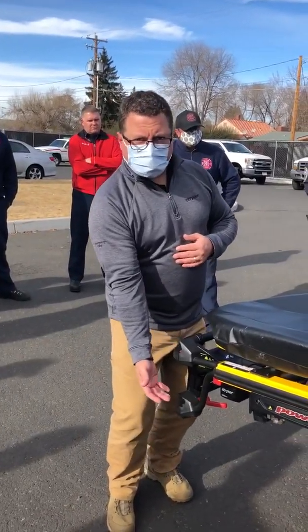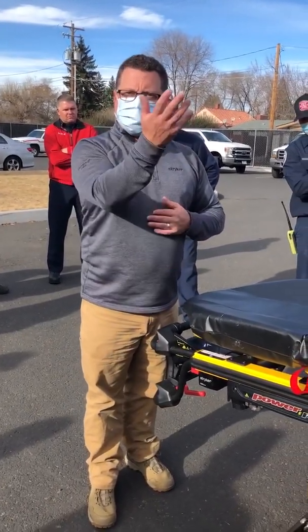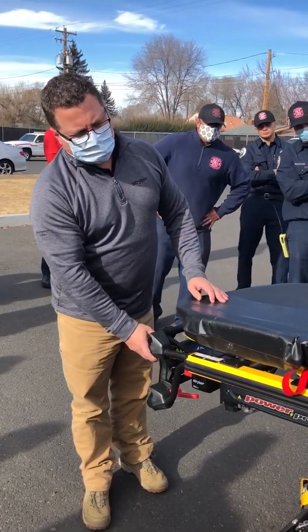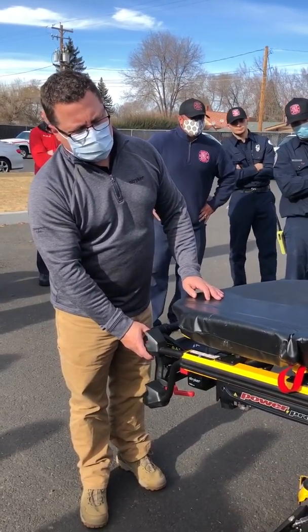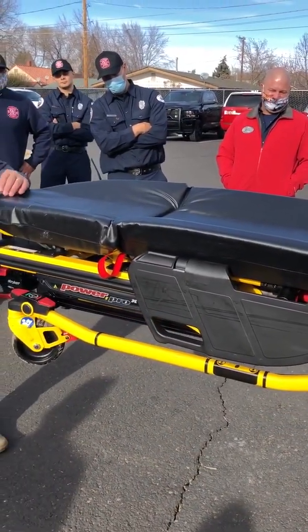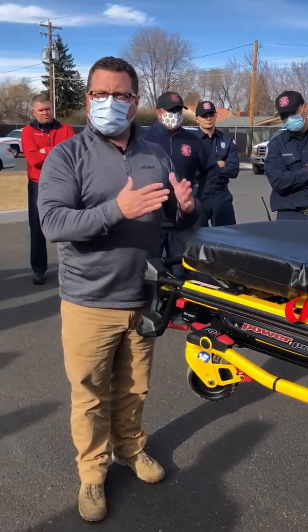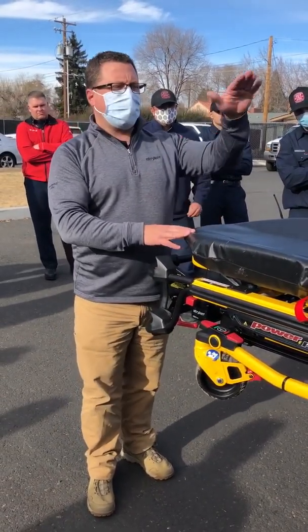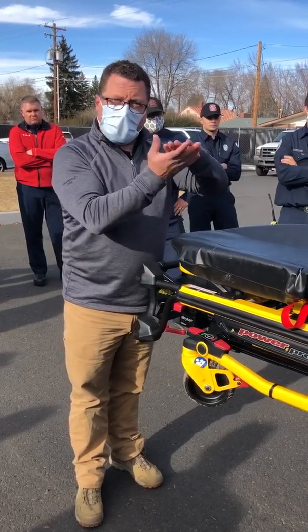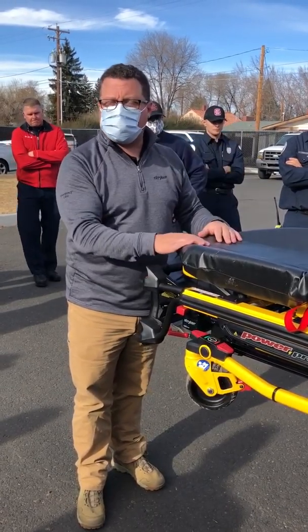Now it's going to work in reverse. Power load will lift it, and once it has the patient's weight, the gurney will extract its legs. You see how tight it got right at the very end — it's really critical you let it finish its function before you go to slide it in. Because if it's not fully collapsed, you're probably going to have a hard time getting it latched in.